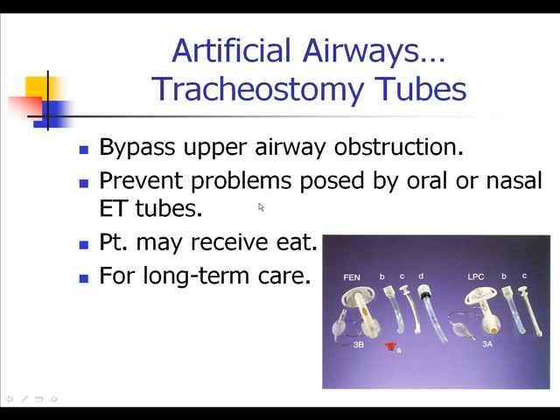They could eventually start to eat, and it's designed for more long-term ventilatory care. Patients do wean from trachs. Some of them, depending on their underlying condition, may be permanently on a ventilator with a tracheostomy in. So it really depends on the underlying state of the patient, which determines whether or not the trach will eventually come out or remain in.